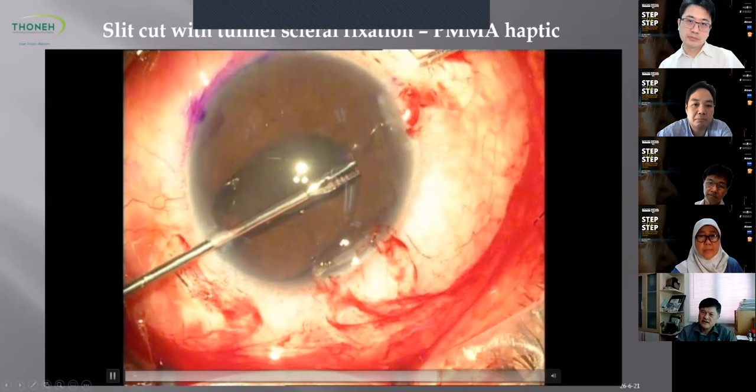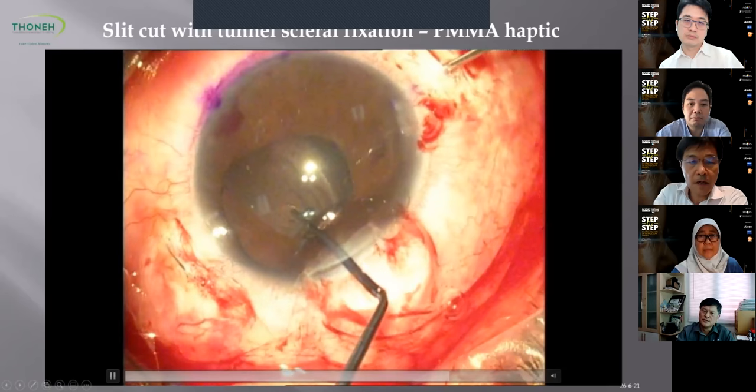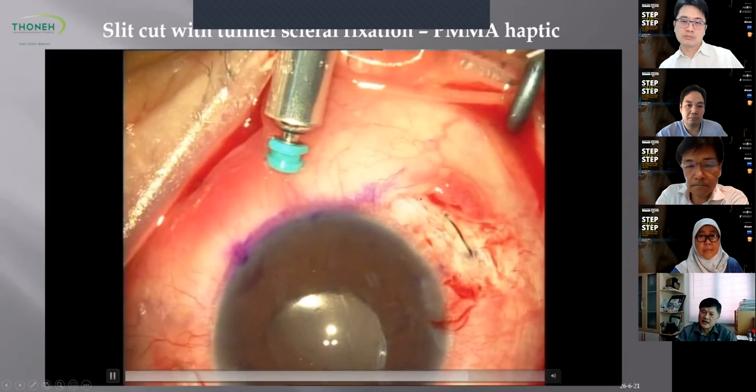This eye has a very small pupil, so there's a little bit more manipulation on the optics, trying to push it in behind the pupil. When you bring up the haptic, bring it up in a very controlled fashion, slowly, horizontally, so that you don't suddenly pull the whole haptic too far out, okay? Otherwise, the other end may get pulled into the eye again.